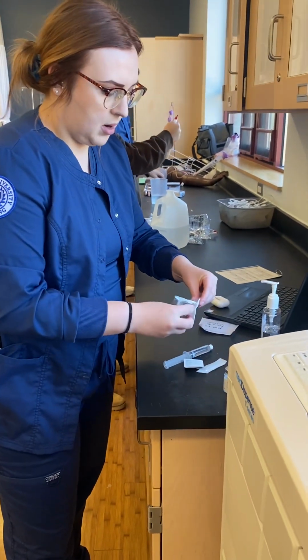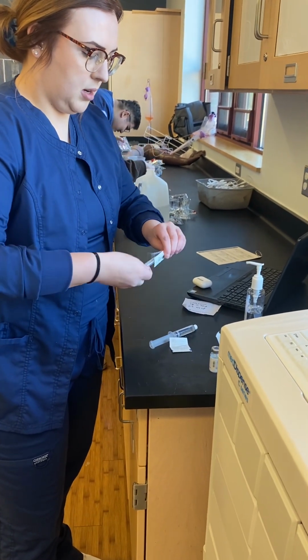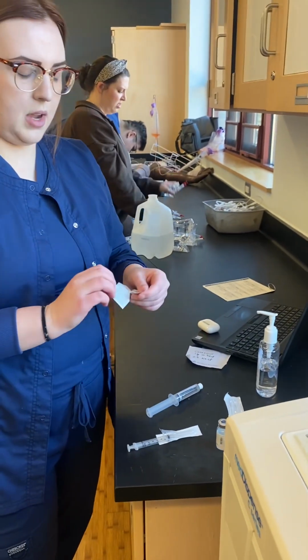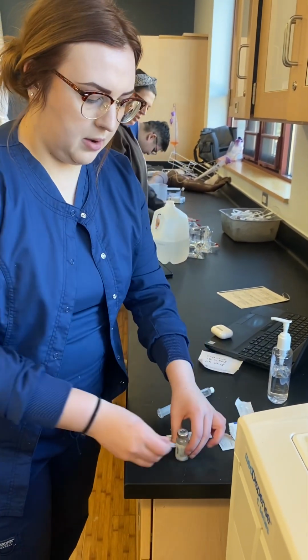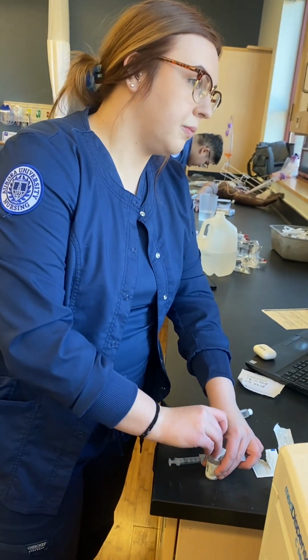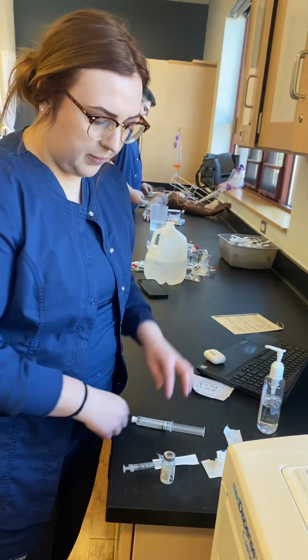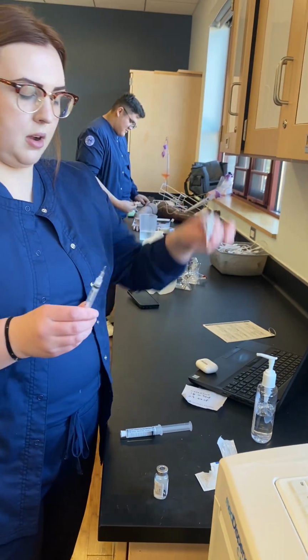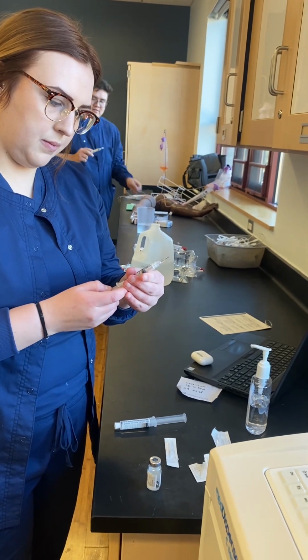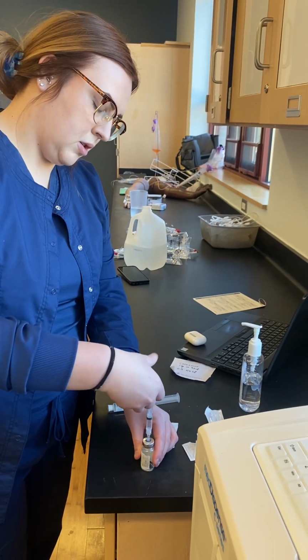So I'm gonna grab my syringe, attach it to my blunt cannula needle. I'm going to disinfect the top of my vial for 10 seconds. Perfect. I'll have my saline ready to bring with me. Take the cap off. Draw up 1 milliliter. Perfect. Inject the air.